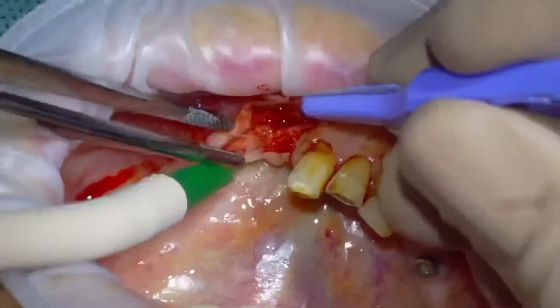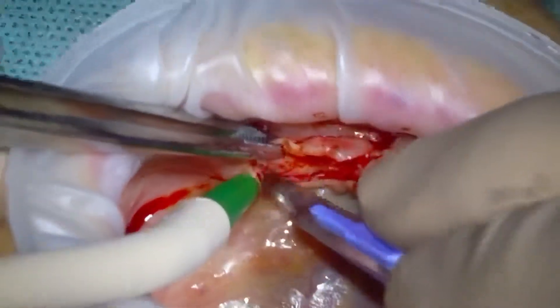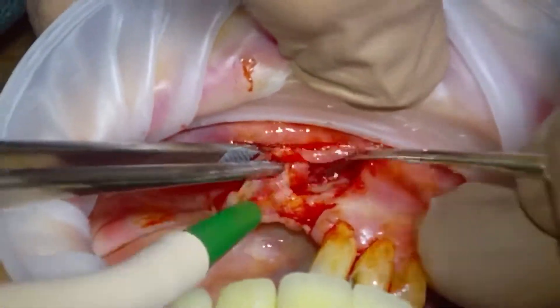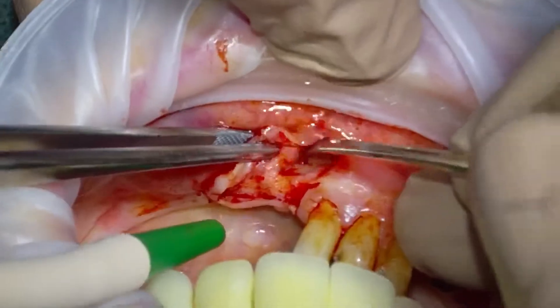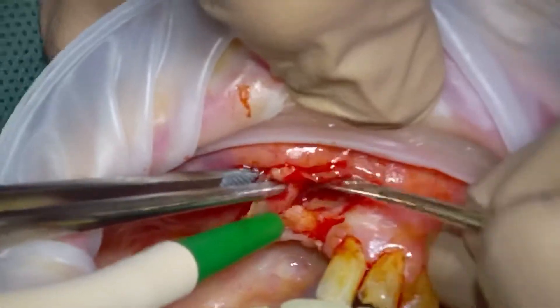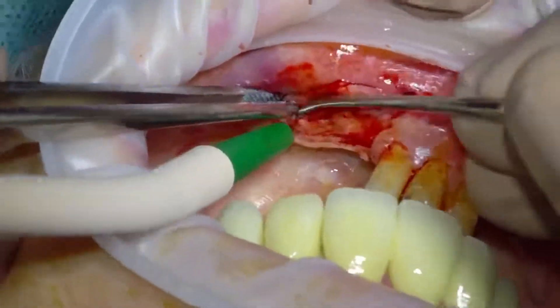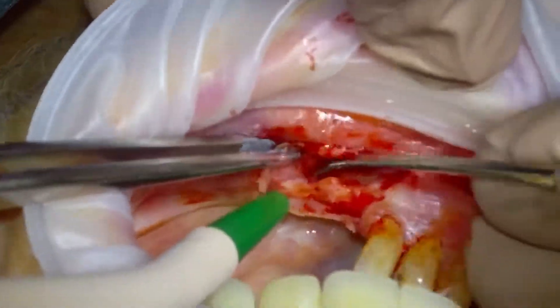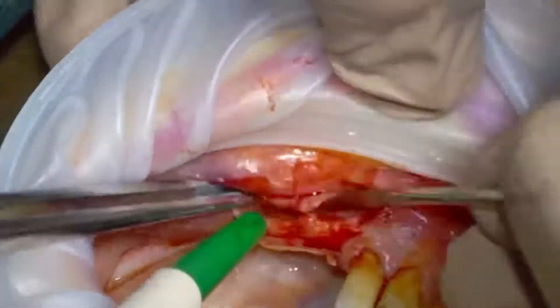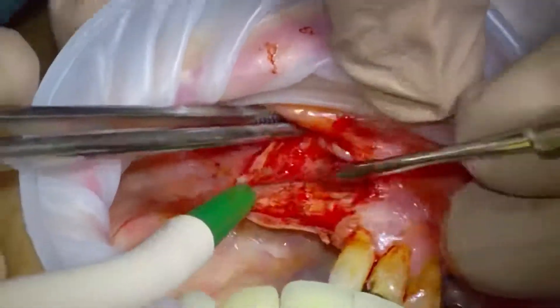It's in the lower left 2-3-4-5 region where we're going to be rebuilding the bone. As you can see, sometimes the keratinized mucosa and the periosteum can get quite stuck, especially around a bony irregularity, so we just elevate the little lingual flap. I've speeded up the video because it's quite a slow process to do it atraumatically.